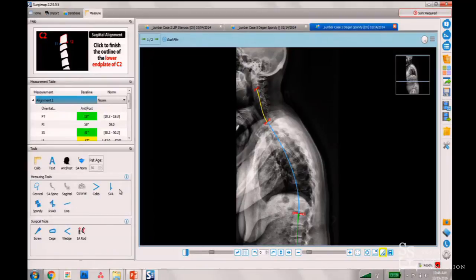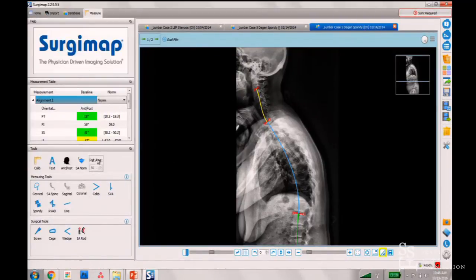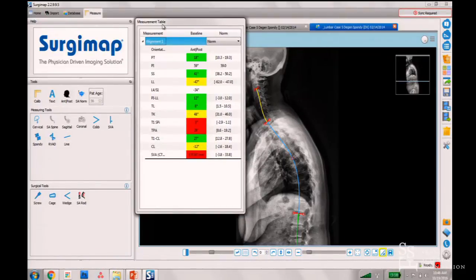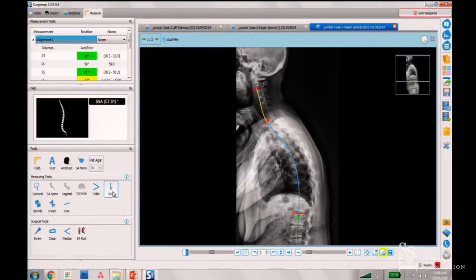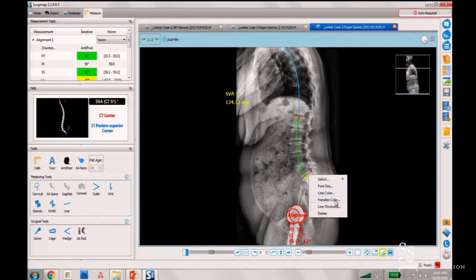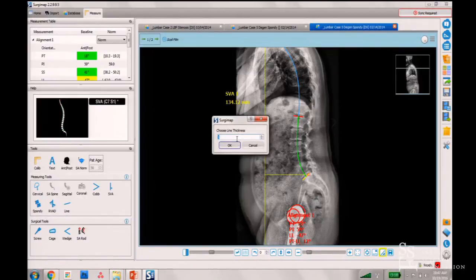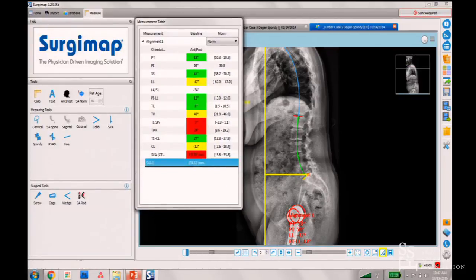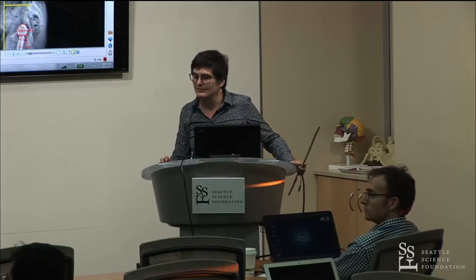So we have a 56-year-old patient. We do the same type of measurement. What's going on is a global malalignment — a positive SVA. I can drop the SVA line for a visual representation. Think about the SVA as the consequence of everything else: depending on the shape and orientation of the pelvis and spine, you'll have different SVA values.